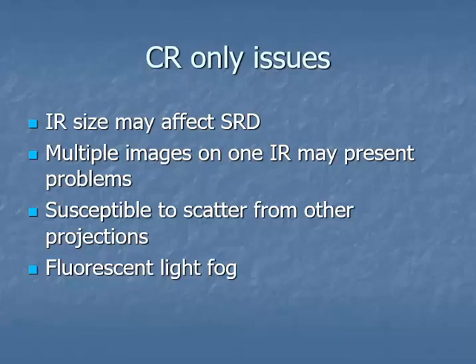And also, along with that, the latent image on the image receptor is only good for a certain period of time as well. So if you have a number of x-rays that you have to take portably up in the patient's rooms, in different rooms on the floor, and you don't have that image lifted off that plate in a timely fashion, it starts to fade. So there's a time element there as well. After you make your exposure, you need to get it read as soon as possible.